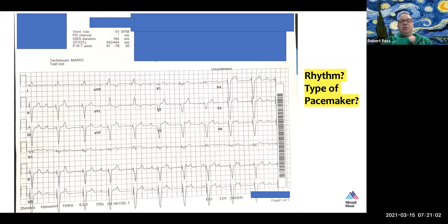And so generally speaking, because by definition a single ventricle is at lower output than a two ventricle patient, we would almost always try to get AV synchrony, whether that would be A pacing in somebody who's in a slow junctional rhythm or AV pacing in someone who is in complete heart block in a single ventricle patient.